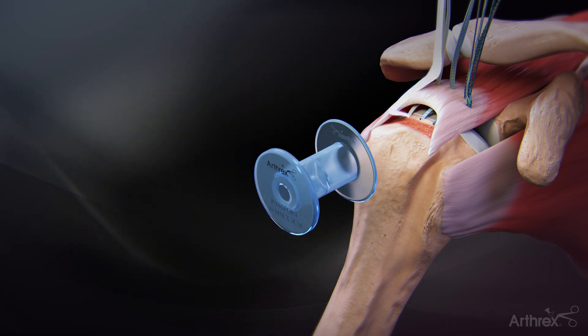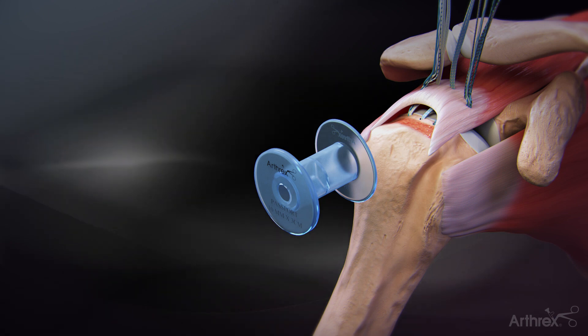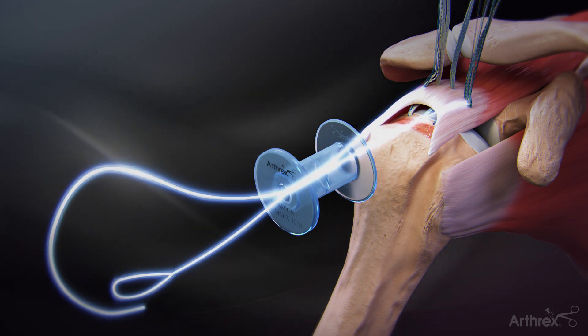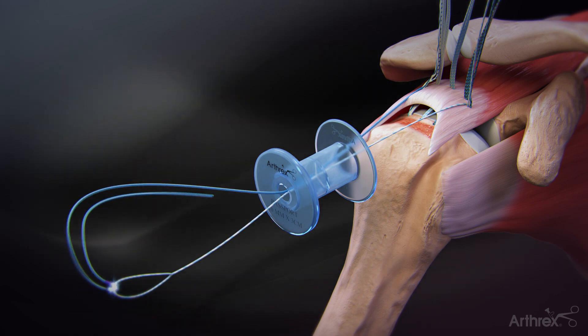Pass the three sutures from the posterior fiber tack anchor through the rotator cuff using the same steps. Using a suture retriever, retrieve the posterior repair suture and the anterior loop end of the shuttling suture through the lateral cannula. Load the repair suture through the loop, folding at the purple mark.